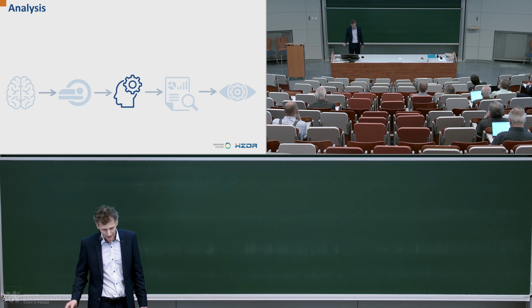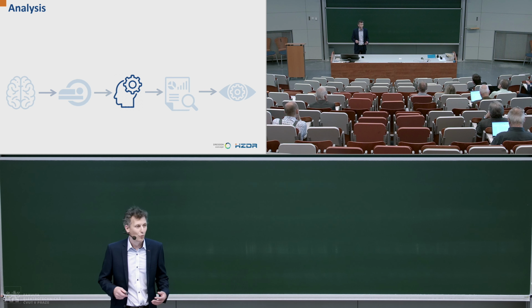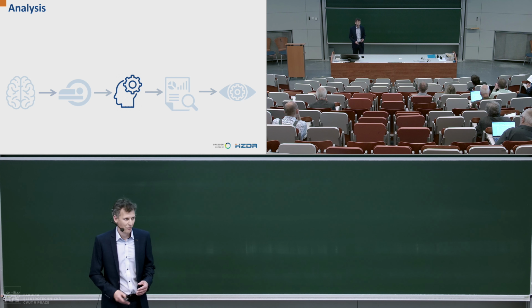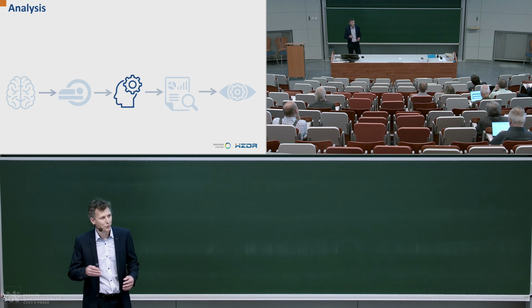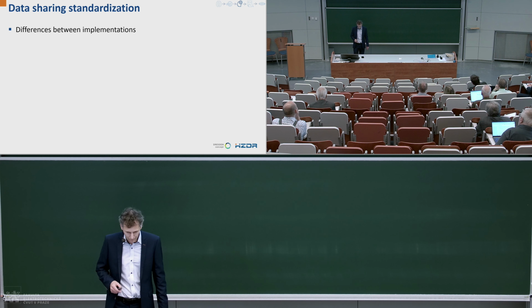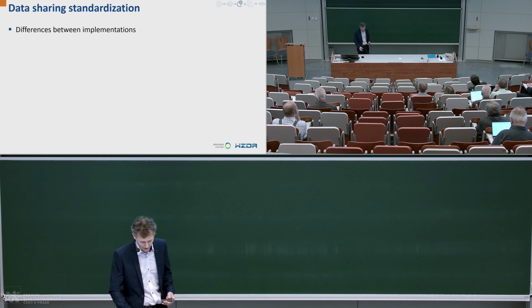Now, unfortunately, there are some challenges related to working with these images. The main challenge is that MRI is traditionally a qualitative method meant to obtain images that are then visually evaluated by medical doctors. With advanced sequences like arterial spin labeling, ASL, we can do quantitative measurements. And for quantitative measurements, we of course need to know the exact parameters of the measurement. We need to properly quantify and process the data to have really good quantitative measurements and not just nicely looking images. So there are four basic issues I want to discuss here related to working with ASL data.